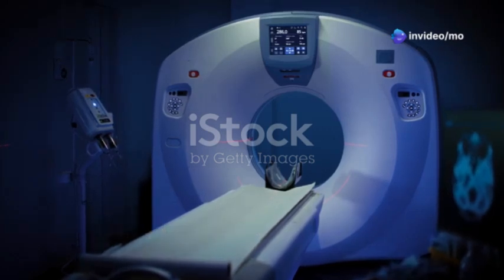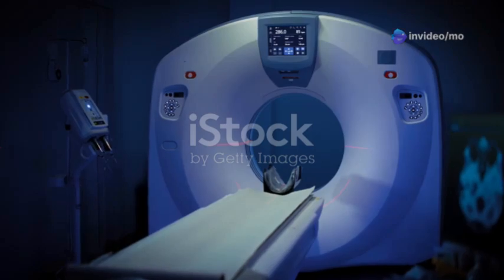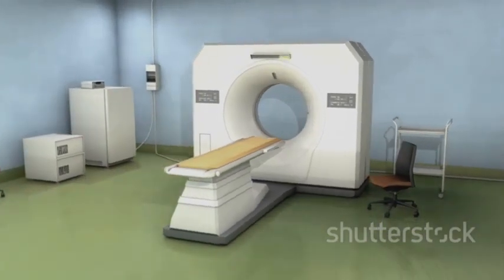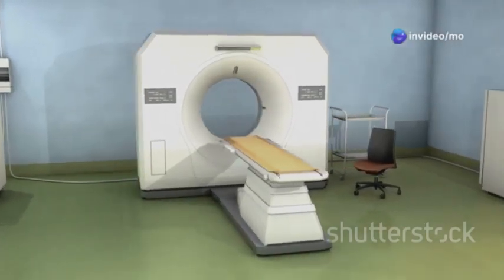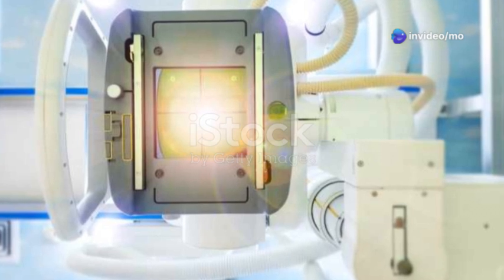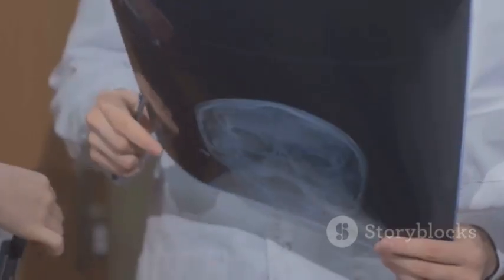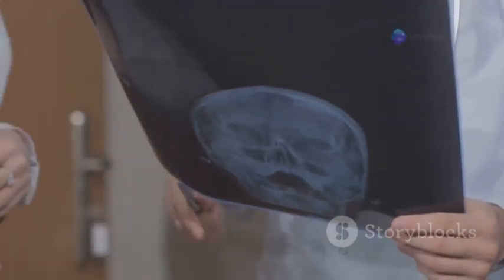A CT scanner might seem like a complicated piece of machinery, but the principle behind it is surprisingly simple. At its core, a CT scanner consists of three main components: an X-ray tube, radiation detectors, and a motorized table. The X-ray tube, similar to the one used in traditional X-ray imaging, emits a narrow beam of X-rays that pass through the patient's body. As these X-rays travel through different tissues, they are absorbed or attenuated to varying degrees.